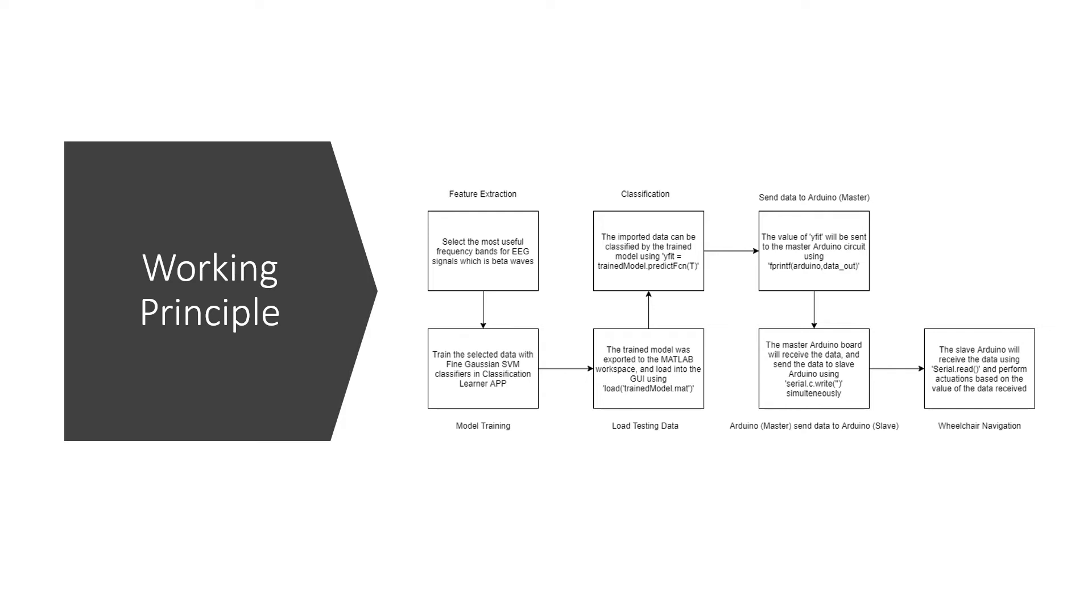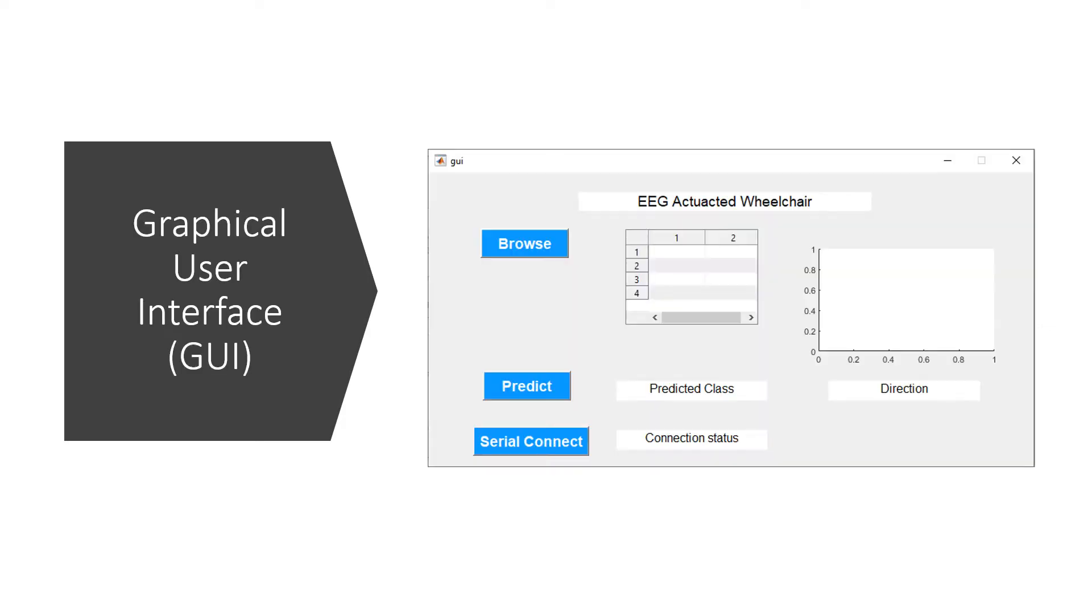Finally, the wheelchair will be actuating the command according to the brainwave signal. This is the graphical user interface GUI created for the EEG actuator wheelchair. In this GUI, there are three main buttons which are the Browse, Predict and Serial Connect.